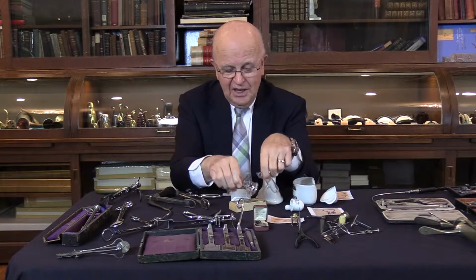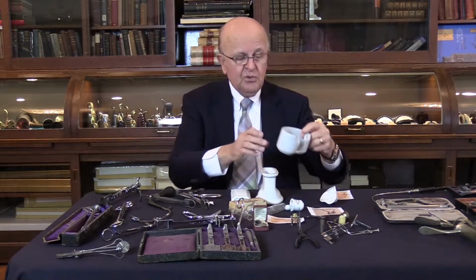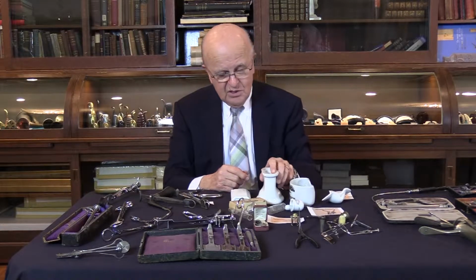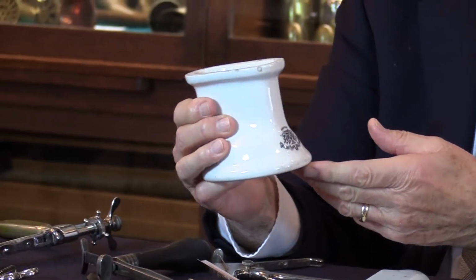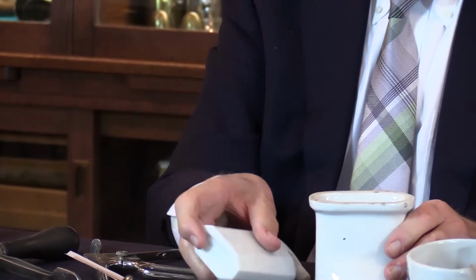There are several other types of nasal douches. This is one example of a nasal douche, where you put your nose through this and tilt it and suck the fluids in. The same principle here. I thought this was very interesting. It looks like a commode, but it used to be used for washing the nose and the sinuses, the same thing here.